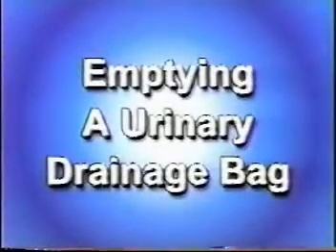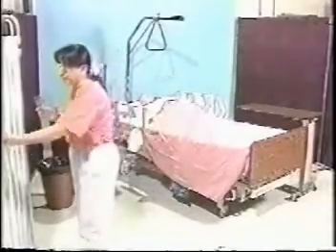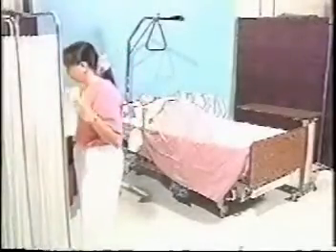Emptying the urinary drainage bag. Wash your hands and put on your gloves. Gather your needed supplies and explain the procedure to the patient. Remember to provide for privacy.